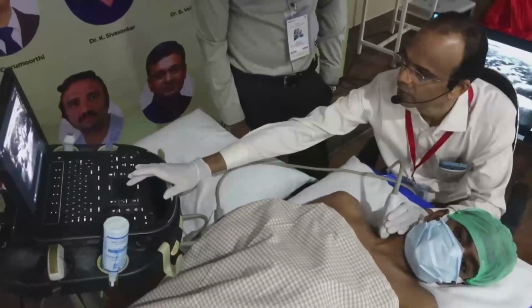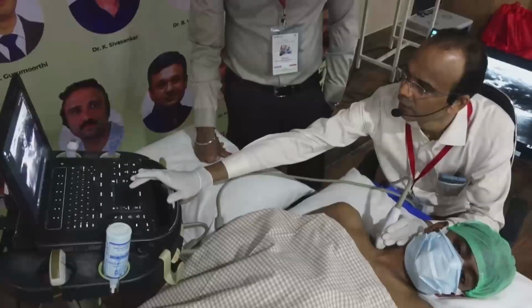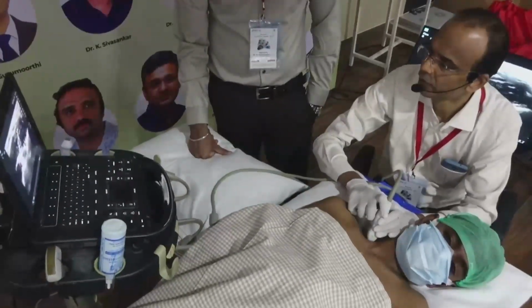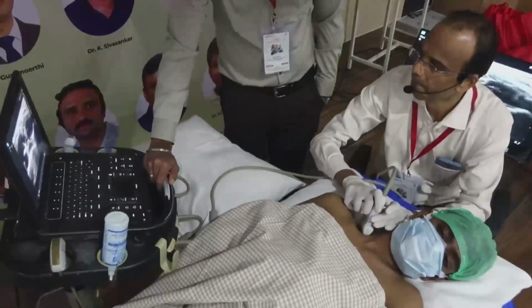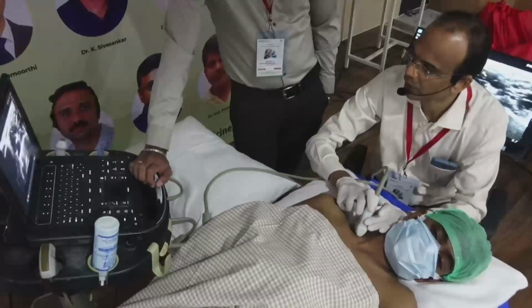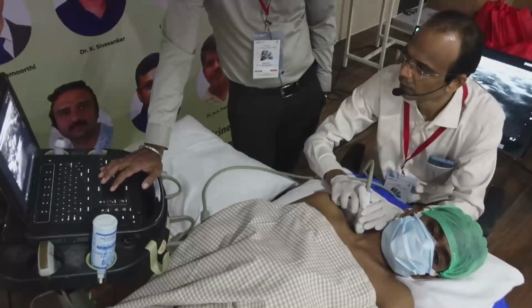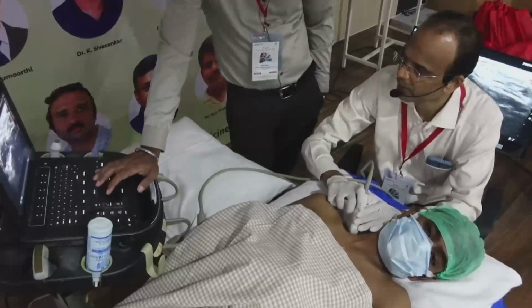If you see, three components are here. If you closely see, now it has started dividing. Now you have to identify one more muscle, that is the omohyoid muscle here.